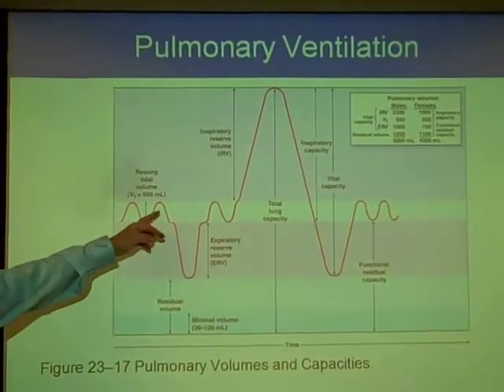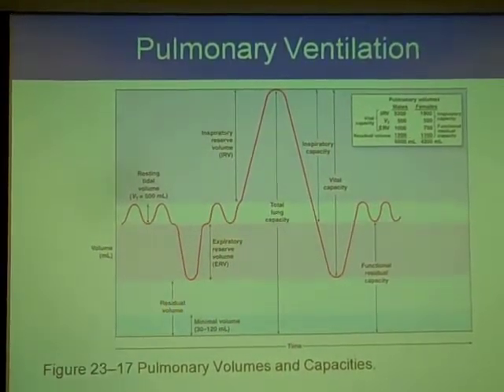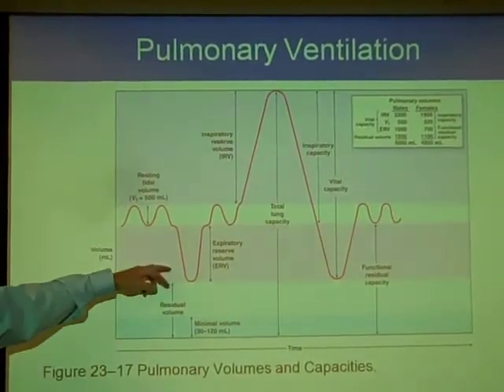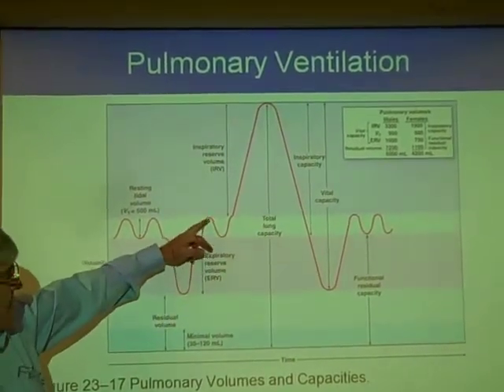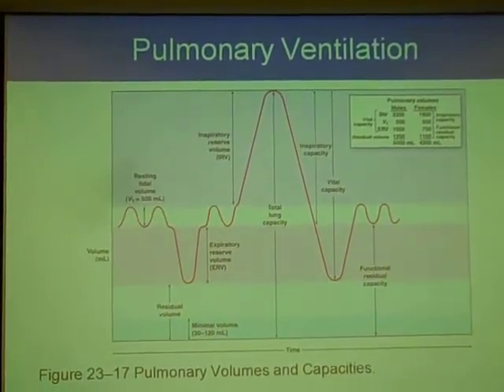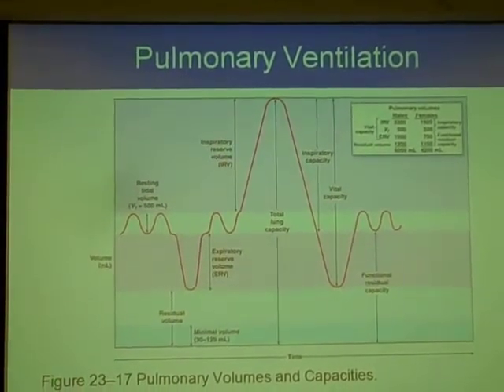But at the end of a tidal volume, when you've breathed out, there's a volume that you can breathe out beyond that called the expiratory reserve volume, the ERV. And you notice that's here, and so that's another volume we'll be able to test for today. And then at the end of a tidal volume, when you've taken in a regular breath, the amount that you're able to inspire beyond that point is called the inspiratory reserve volume, or the IRV.